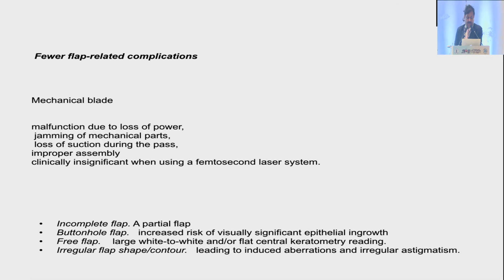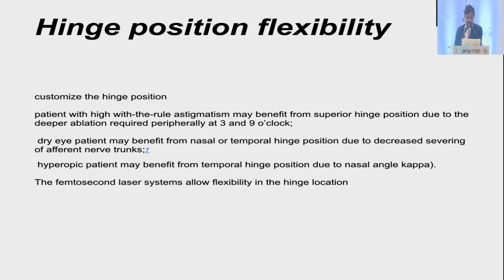When you talk of mechanical blades, sometimes you can have malfunction because of the loss of power. We have seen a lot of times the mechanical parts get jammed. There can be a loss of suction. You can have improper assembly when your assistant really makes your day hell. Clinically insignificant, but when you use a femtosecond laser system, all these complications boil down to a very low incidence when you're talking of the femto-based platform.